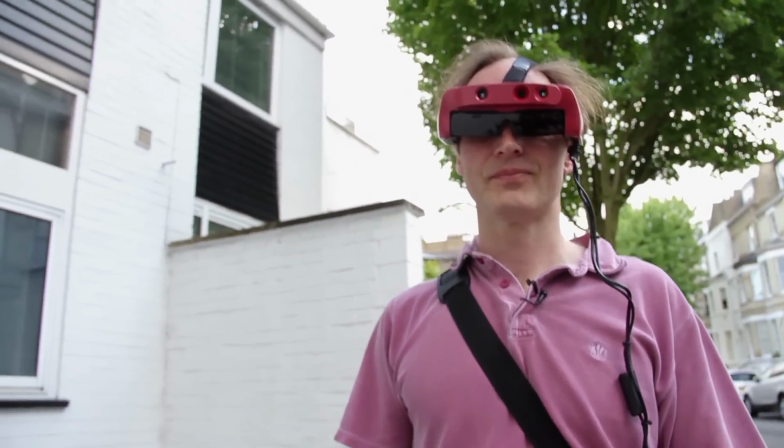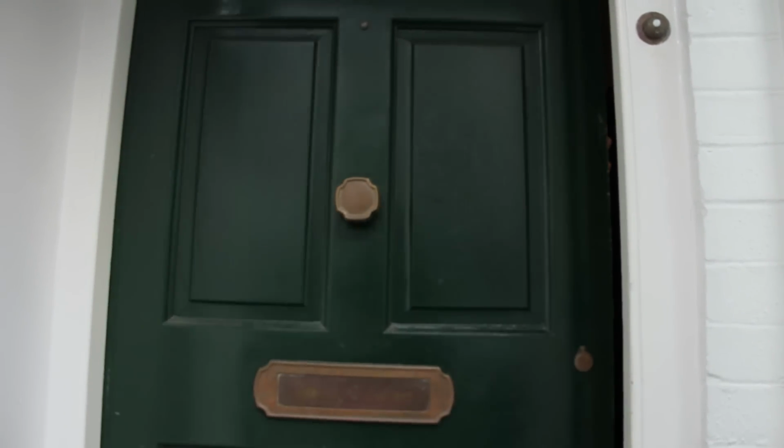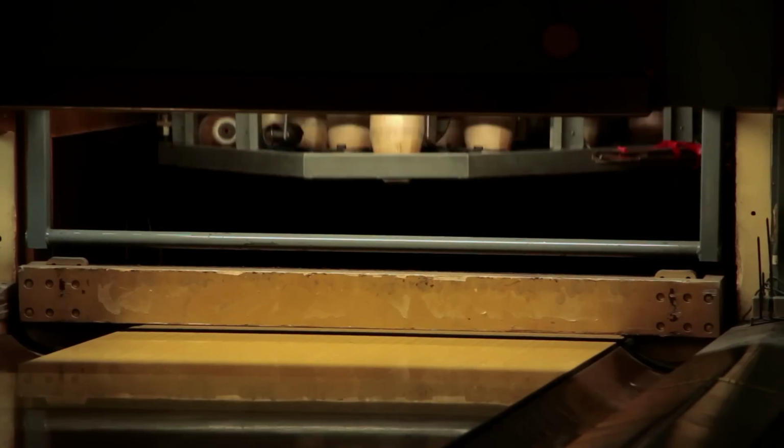The smart glasses work by enhancing any of the remaining vision that people have. We have a camera system that detects objects that are important, such as an obstacle or a person's face, and we project that on the inside of a pair of lenses.